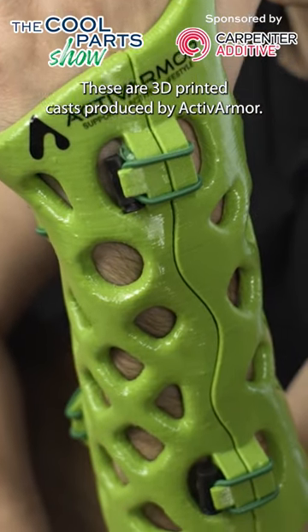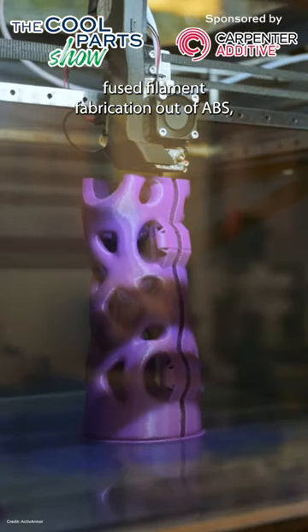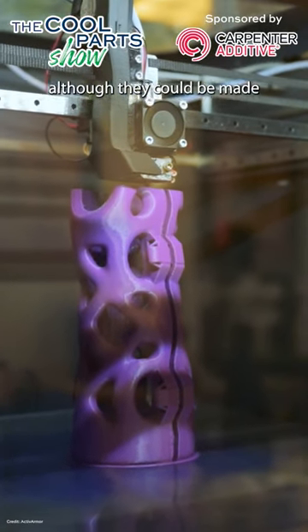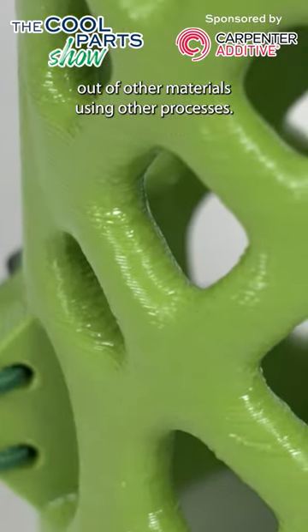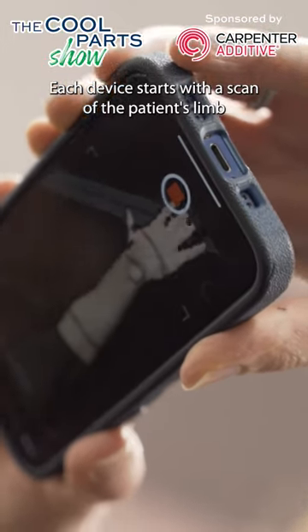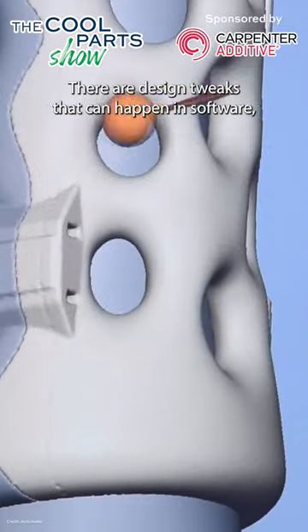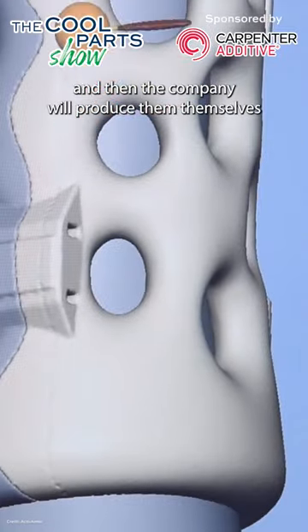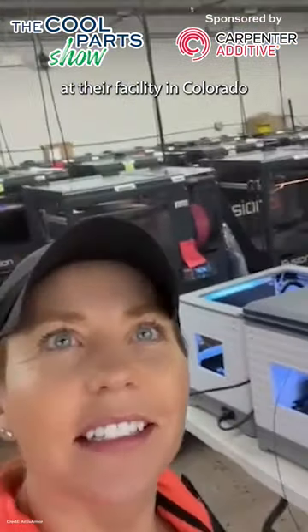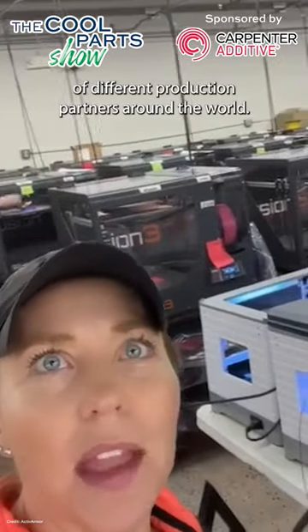These are 3D printed casts produced by ActiveArmor. The ones that we have here were produced through fused filament fabrication out of ABS, although they could be made out of other materials using other processes. Each device starts with a scan of the patient's limb using a smartphone app. There are design tweaks that can happen in software, and then the company will produce them themselves at their facility in Colorado or through a number of different production partners around the world.